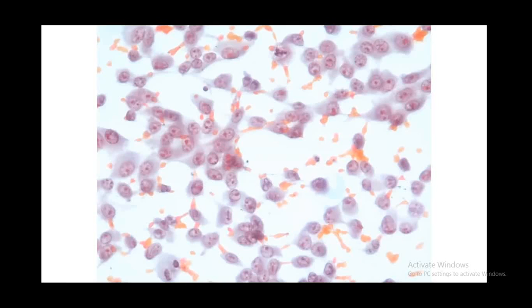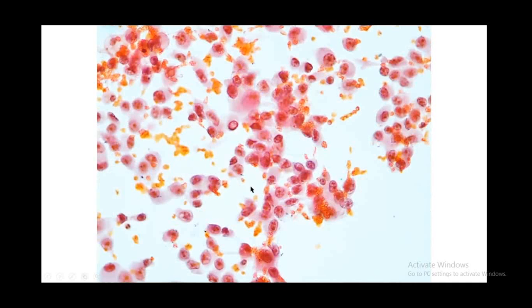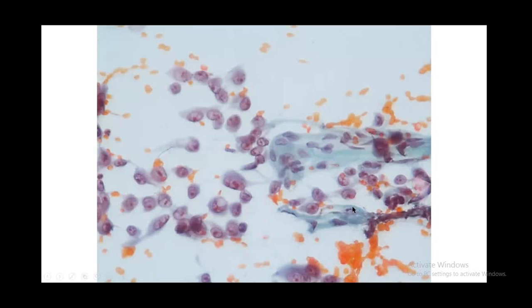The cytoplasm, in some cells, appeared spindle to stellate. And the intranuclear inclusions were identified, but the nuclear atypia appeared quite conspicuous on these smears. Again, intranuclear inclusions were seen, but the cells started looking anaplastic. A few vascular fragments were also noted along with these cells.